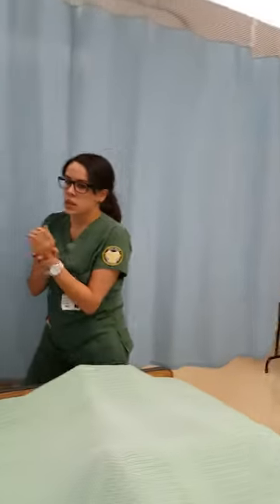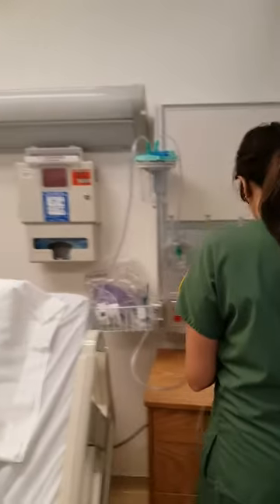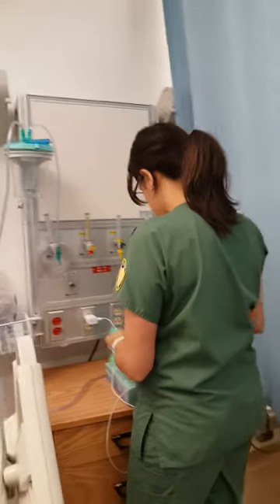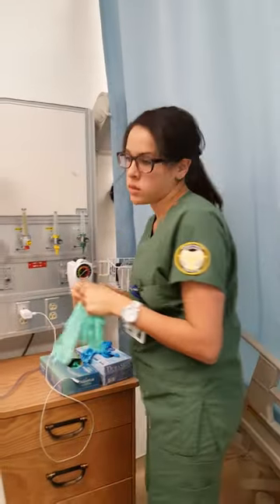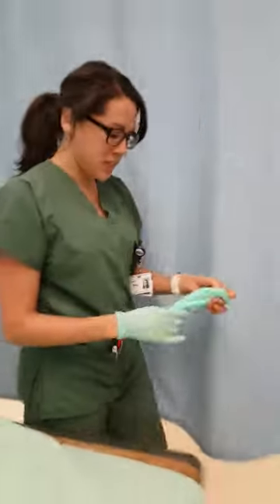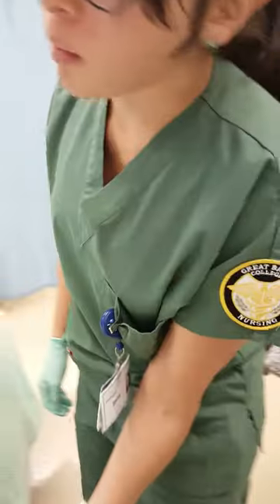So I'm just gonna make sure that the suctioning is working and it's on the prescribed amount. I'm just gonna put your bed up a little bit, okay? Okay.